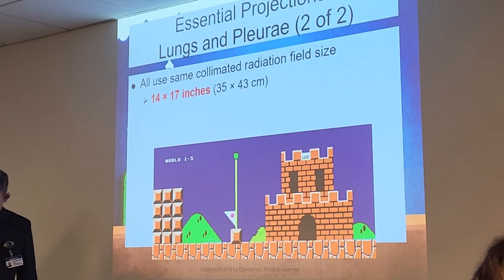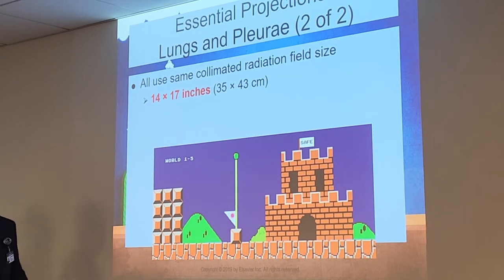All right, all of our decubitus x-rays are going to use a 14 by 17 cassette, no matter which one we are doing. 14 by 17 cassette.